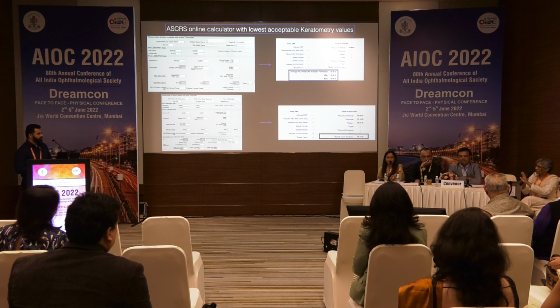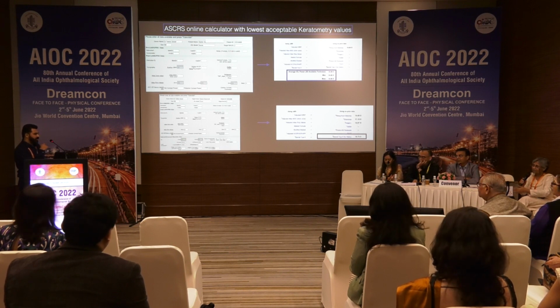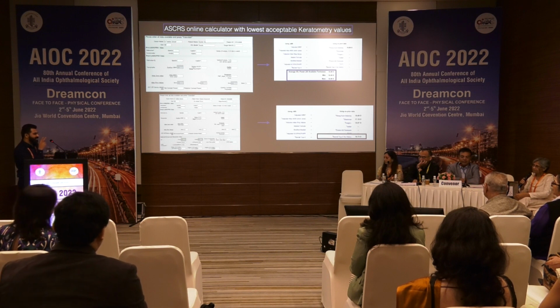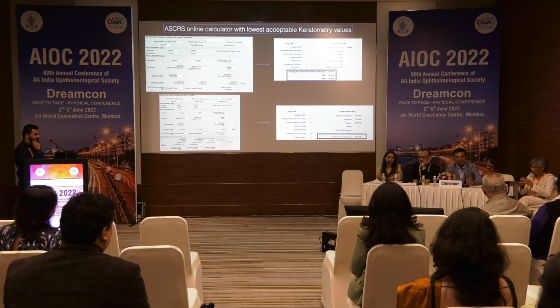It's all fantastic what you have done, but I just wanted to know, did you use only one instrument to measure it? We have one LENSTAR at one of the centers. We didn't get a measurement with that. Neither did we with the IOL Master. The IOL Master we have is the slightly older one. Despite two instruments, you got no readings. That means whatever readings you were getting are absolutely right. Then I think we'll just follow what you have done.